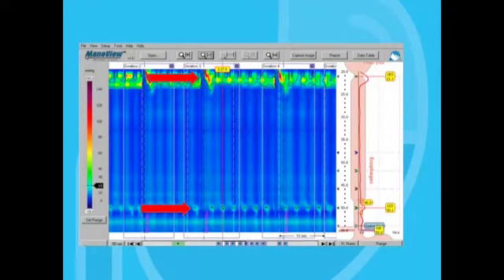How would you distinguish between absent contractility and type 1 achalasia? That is an excellent point, and it is a potential diagnostic pitfall for the clinician.